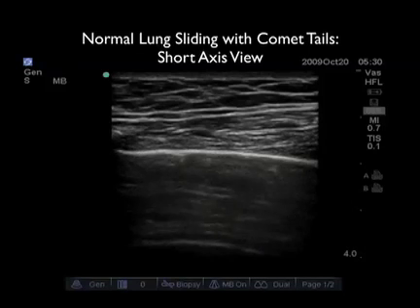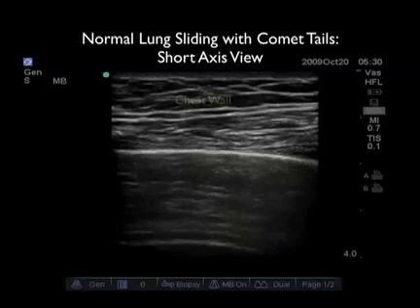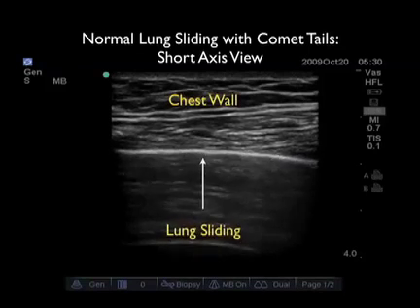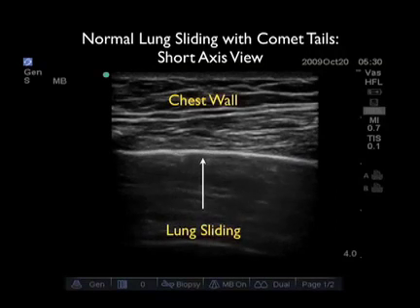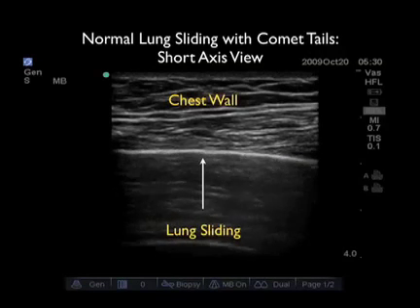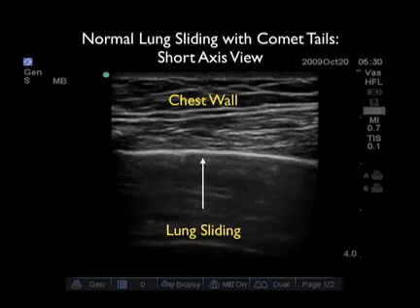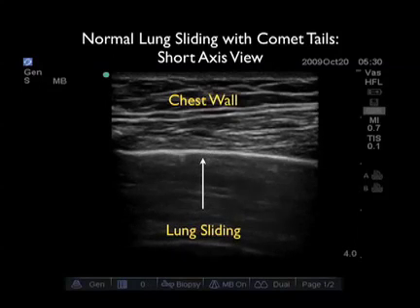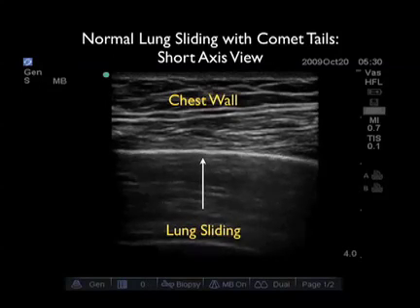We should also swivel the probe into the short axis configuration to further examine the lung. And what we see here is a normal lung in short axis configuration. Note here we're looking in between the ribs, so all we see is the dome of the lung. Notice that it slides back and forth as the patient breathes, and we see the vertical comet tails coming off the back — a completely normal examination in the short axis plane.